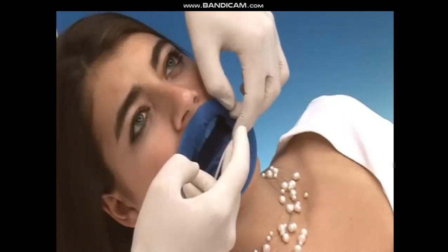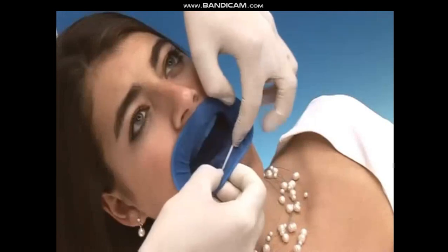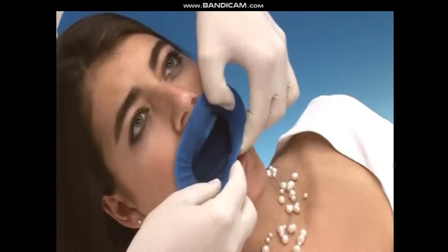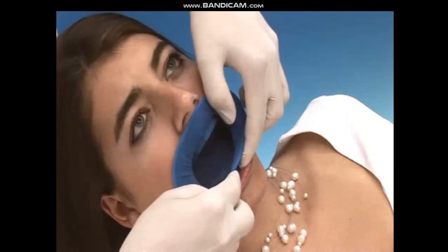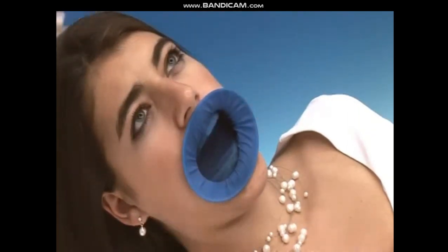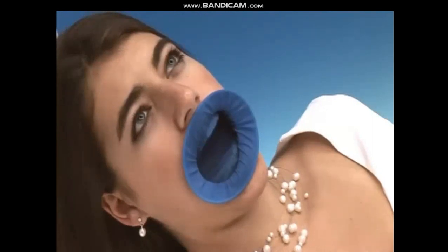In the fourth and final step, the intraoral ring is placed in the fold behind the lower lip. The octradam now sits perfectly in the fold, ensuring an ideal fit during treatment as well as during opening and closing of the mouth.